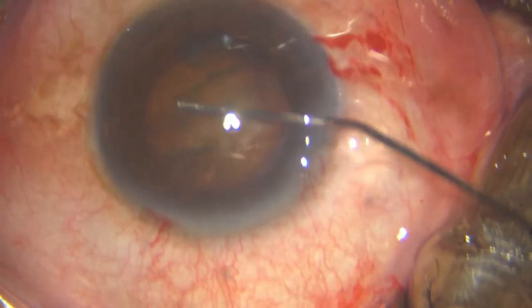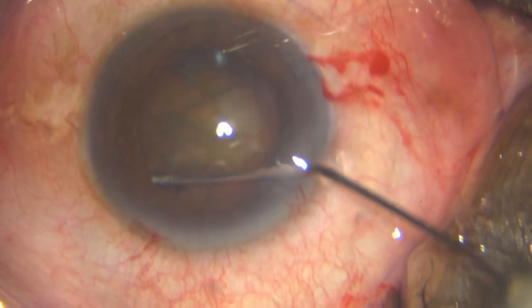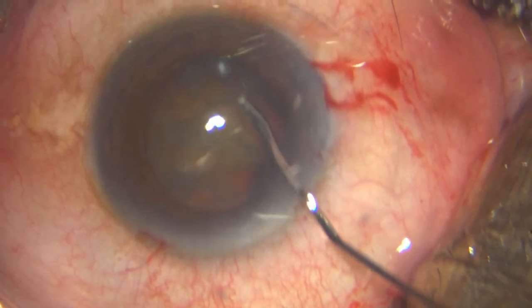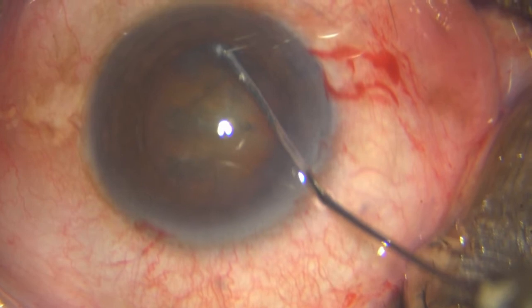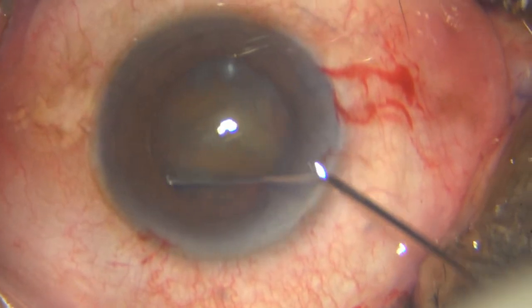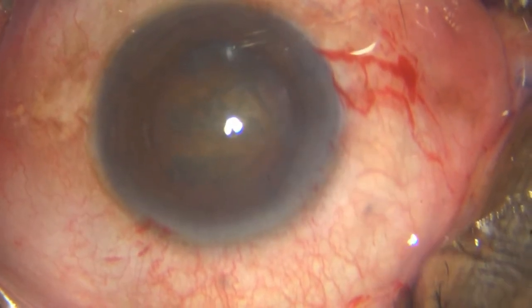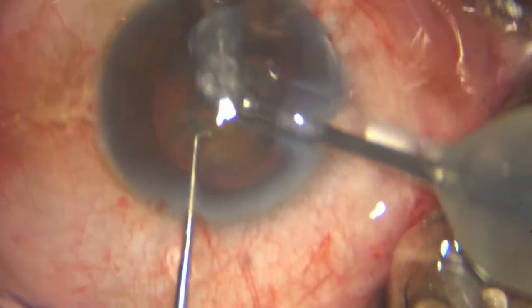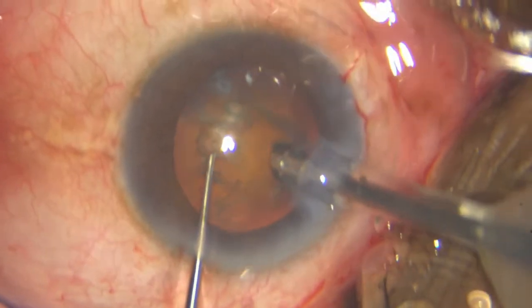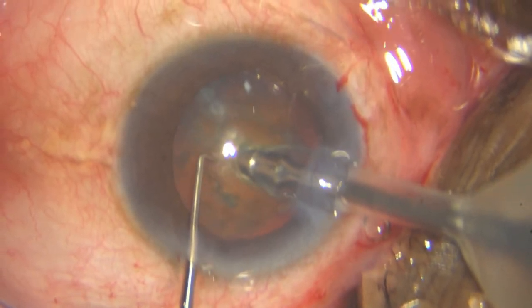I then go ahead and do the hydrodissection — watch that nucleus movement forward, just to ensure that it has been done. I'm always having my eye on that calcific spot in the lower capsule, and that's why I avoided the rhexis going there. I avoided that rhexis engaging that calcific spot, and hence the smaller rhexis.